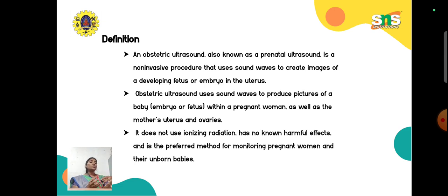Based on the baby's movement, it will reflect a certain amount of frequency. You have some kind of shift because of the baby's movement or the different layers of tissues, because the penetration of the sound waves varies from one stage to another as they pass through to the targeted area.